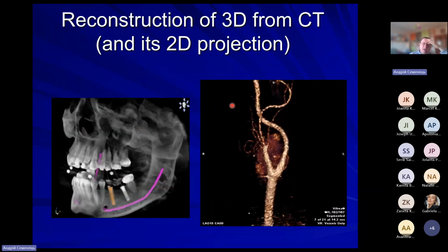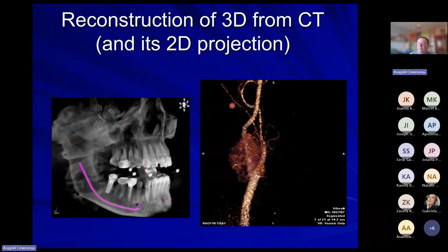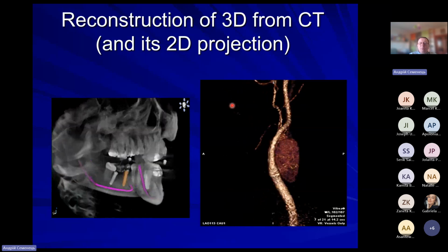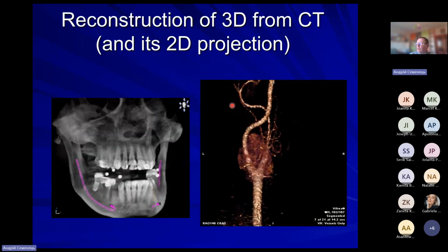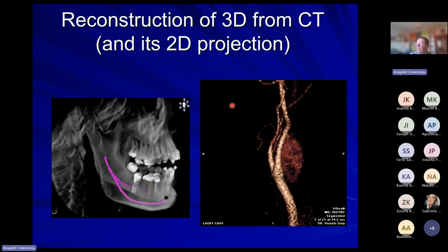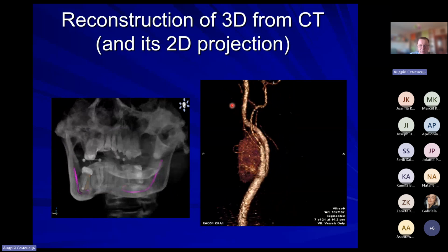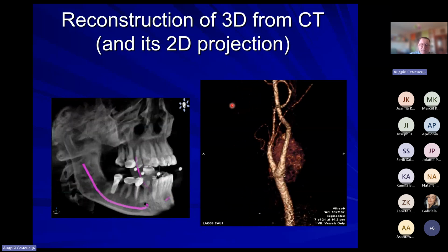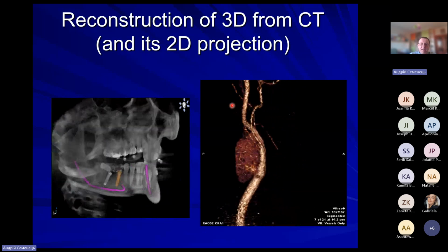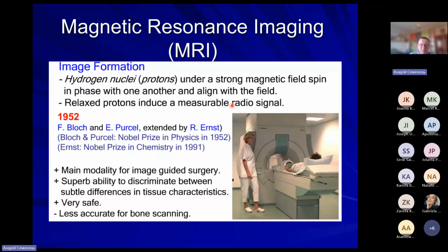So again, we have to understand that all this is in fact not original images. It's all computer models reconstructed through mathematical transformations like the inverted Radon transformation and Fourier transformation from the original projection information. And the quality of this image depends only on the quality of our mathematical models.